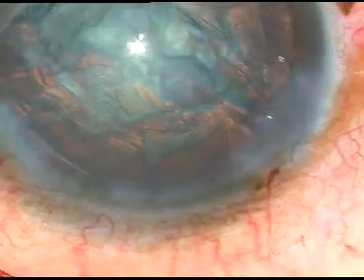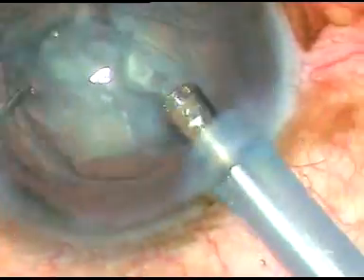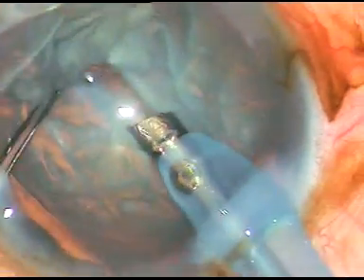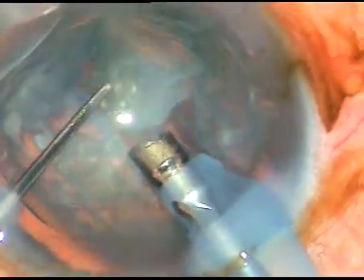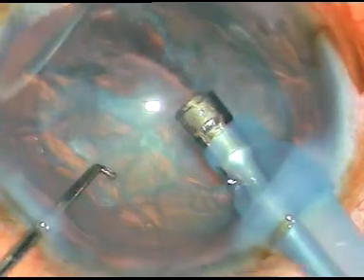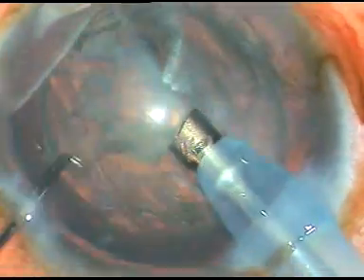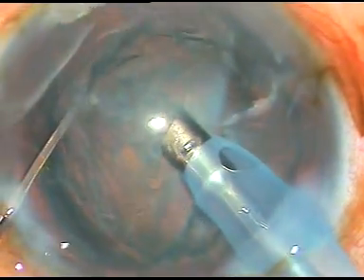So I am sure the bag will not collapse. The CTR will give enough support, and I will be able to emulsify the fragments. Now, yes, now I am able to emulsify the fragments. Now I rotate the other heminucleus. Here it is. Rotate it a bit and then engage it and chop this heminucleus.